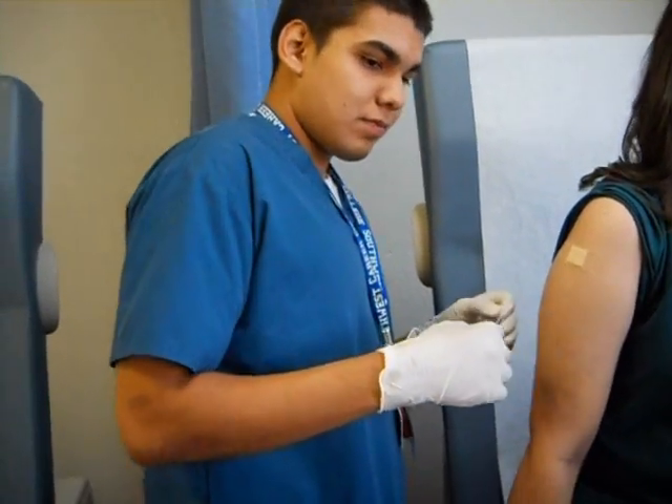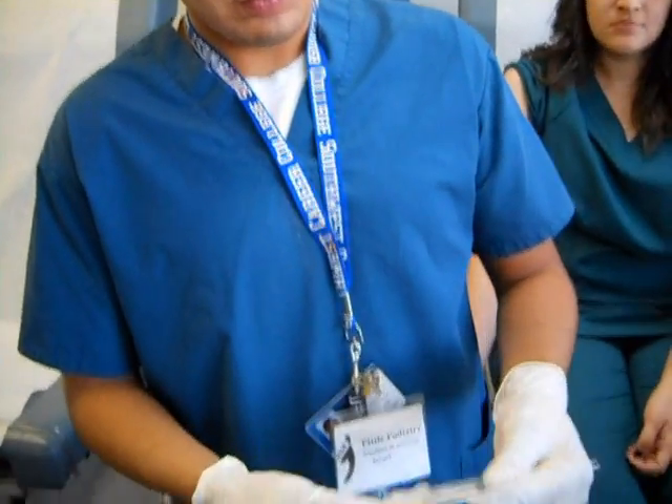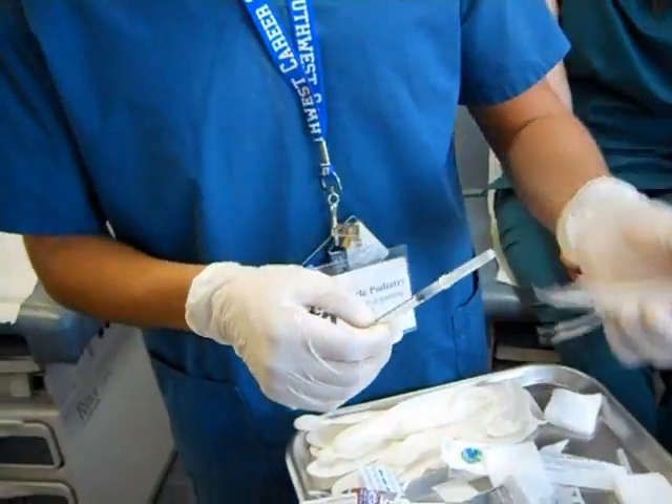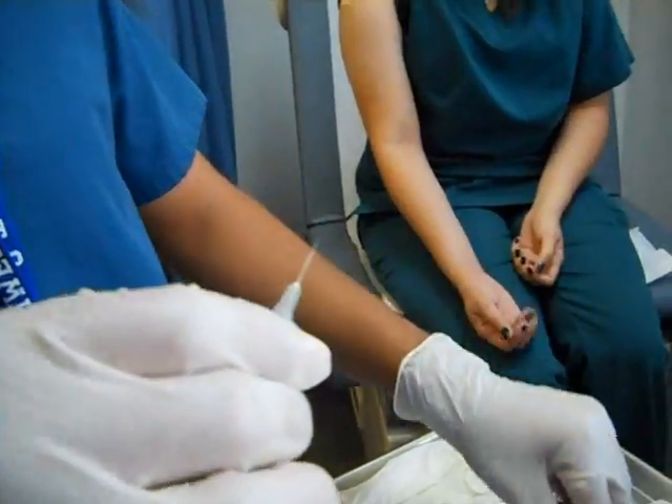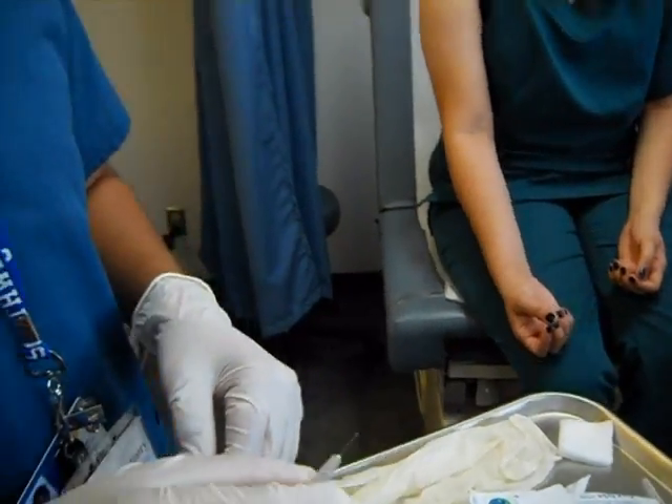The bevel is the opening of the needle. As you can see, every needle has a small opening at the tip — that is known as the bevel.